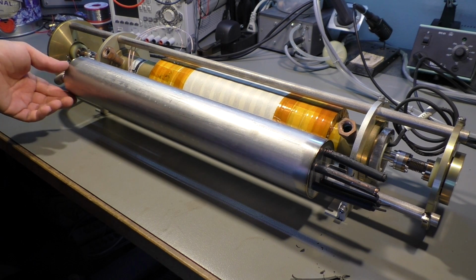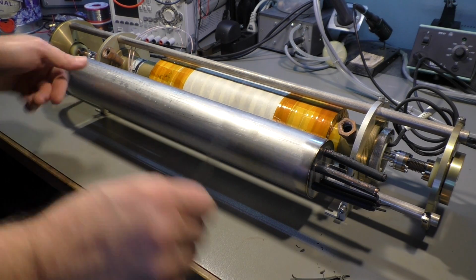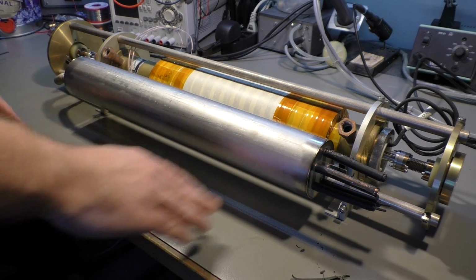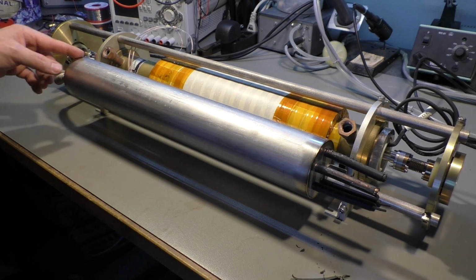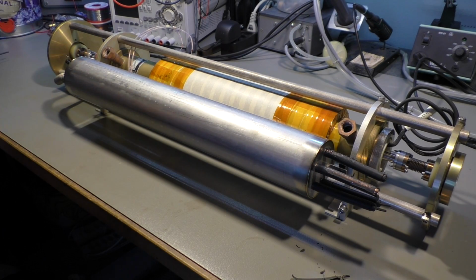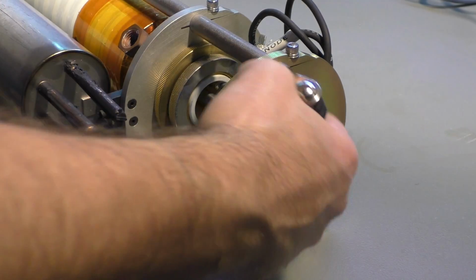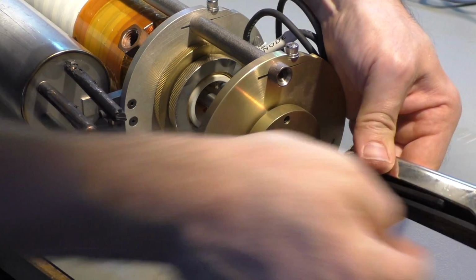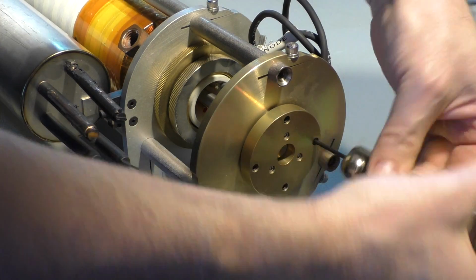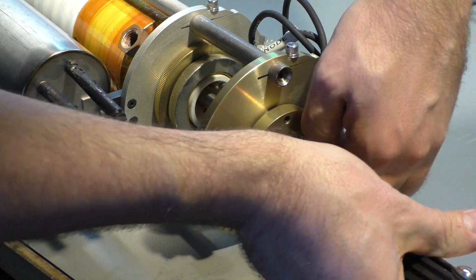Okay, the rest was some sort of heat shrink tube. It's just, I'd say, a stainless steel tube, welded shut here on the top and the bottom. Let's have a look at the output mirror. This round face plate here is attached with 4 screws, and we have 3 screws here, which are, I assume, to adjust the angle of the mirror.